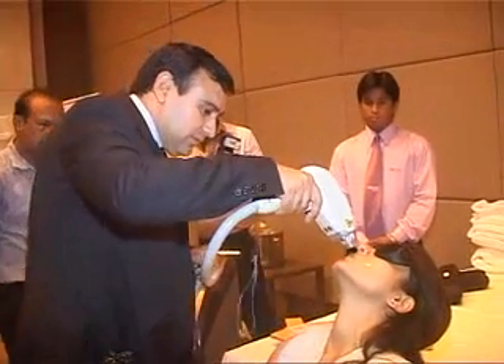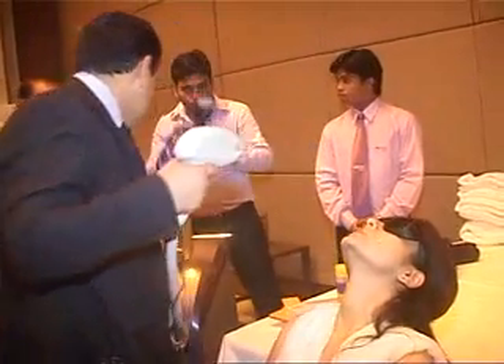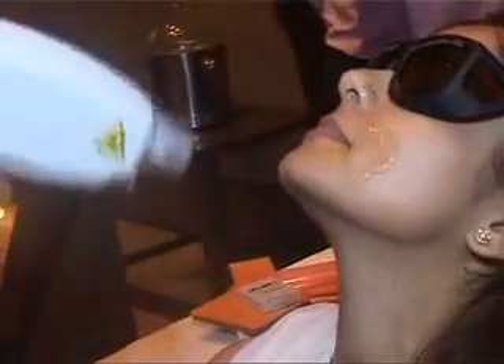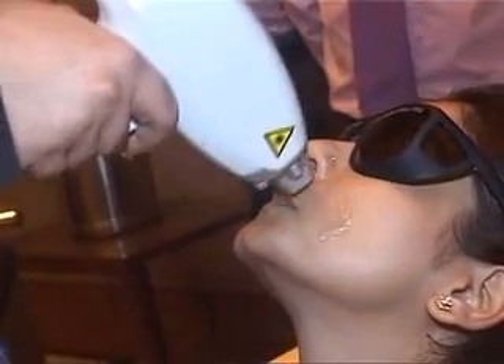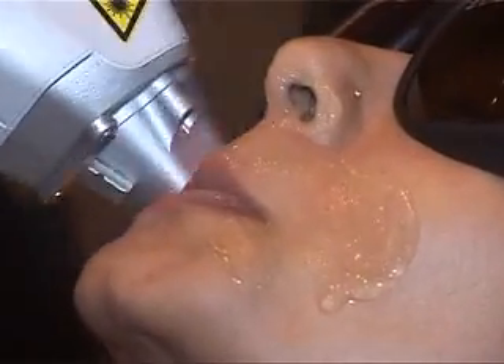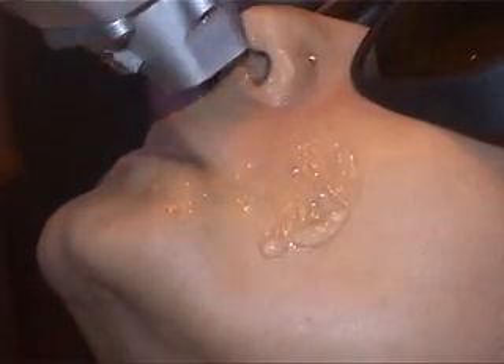The number of passes don't really matter — it's basically the amount of energy that is required to be given. You can see that out of 3 kJ, we have already given 1.9 kJ, so 1.1 kJ more to go. Are you okay, ma'am? Yes. Is it more uncomfortable than expected? It can be a little uncomfortable but not very much. The upper lip is an area where discomfort is felt the maximum because of the teeth being directly under the lip — in fact it is the only place where discomfort can be felt. On the body, like an arm or a leg, there is no discomfort whatsoever.